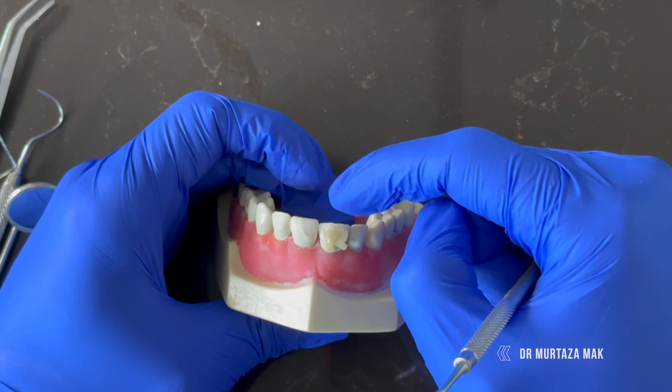Then I start drawing pencil lines, getting the line angles right, looking at all three dimensions of the tooth at every single angle to be more predictable. You will notice that as soon as you start doing cases this way, you will end up being very predictable and your patients will be more happy. At the same time you will notice you are doing more additive dentistry, so most of your preps will be in resin or in enamel — minimal preparation veneers. Once I'm happy, I use burs, or you can use discs, to correct the line angles and shapes.